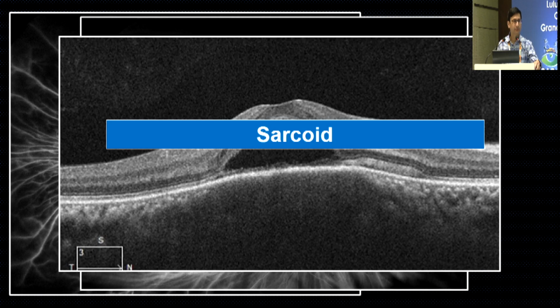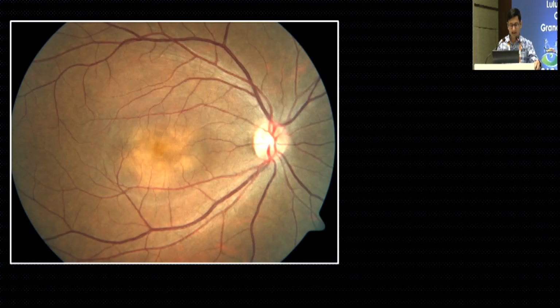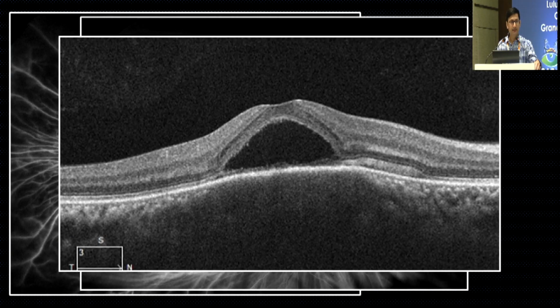Going back to the lesion, you will realize that the lesion has limited amount of yellowness inside the lesion. A TB lesion is generally more yellow, more bright, and associated with much larger volume of fluid, whereas this patient will have much less amount of fluid and you'll have a less intense appearance, and this is true for a granuloma. So moving forward, looking at the imaging, you can possibly lean towards a particular diagnosis.